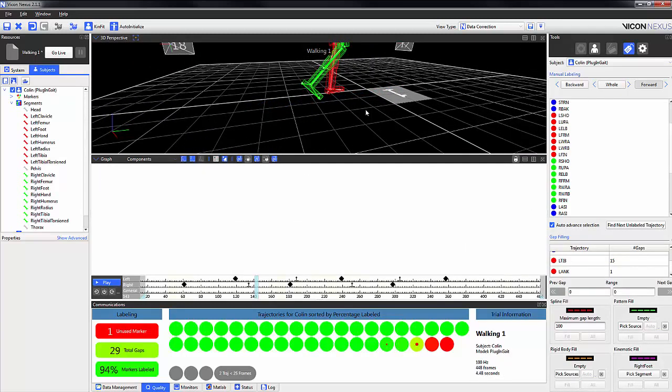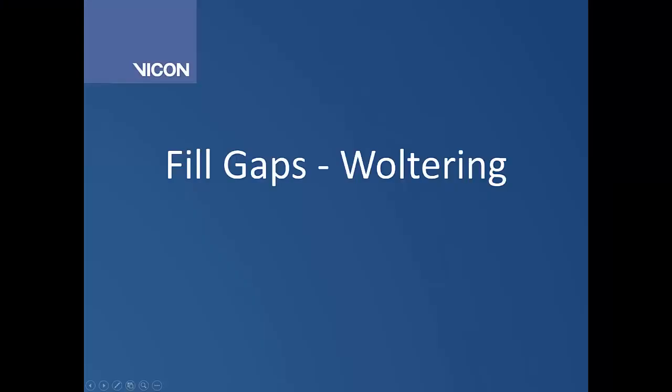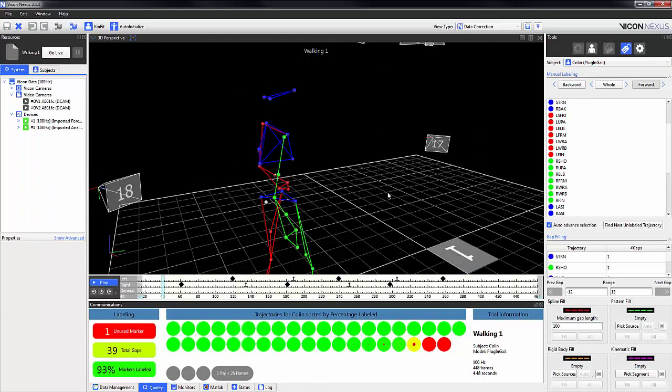For all the gap filling options you have the ability to fill each gap individually or all of them. There are a few other options in the pipeline.